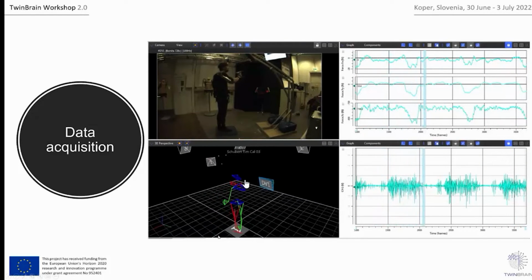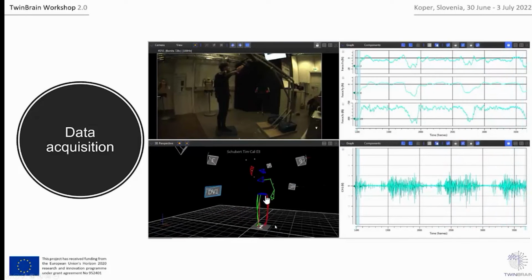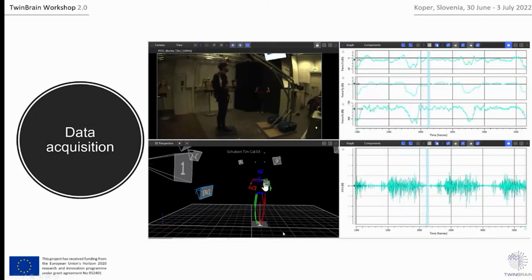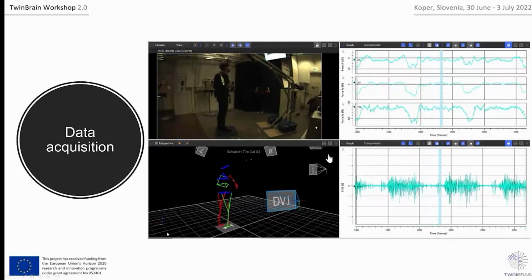We have here a full body model, but in our research, we just prioritized the upper model. So out of this model, the shoulder angles are taken out and analyzed. Especially on the right-hand side, you see, for example, the force being applied on the force plate that we use. I'm not going into that in this presentation. Or as you can see here, the EMG of the right shoulder of the test subject. So you see that every time the right shoulder is being used heavily, the EMG data goes up.